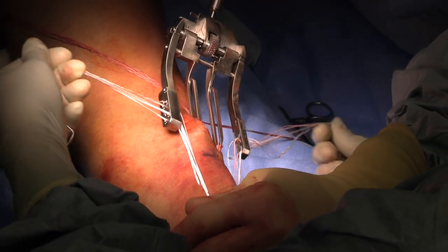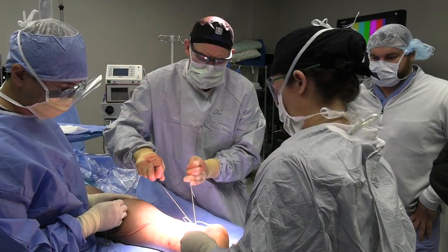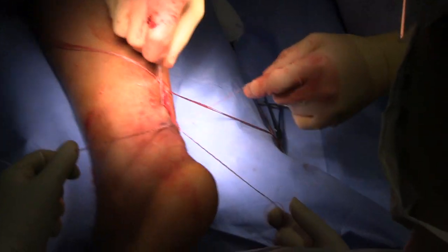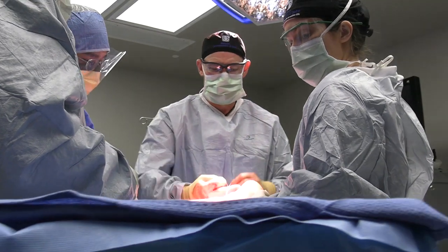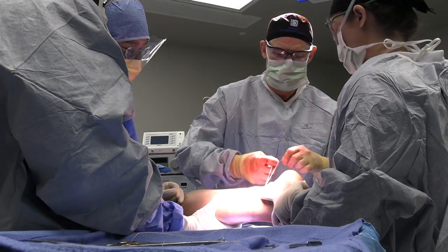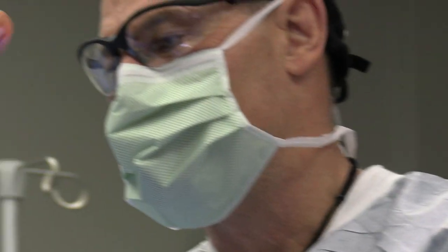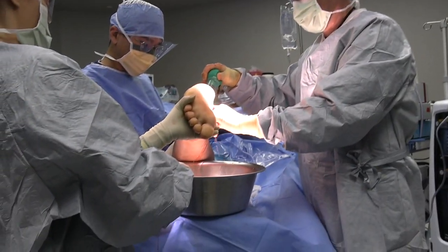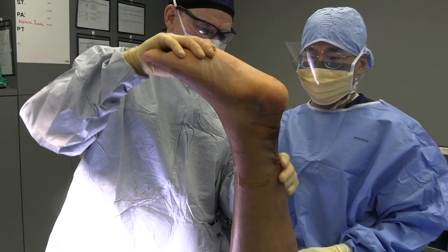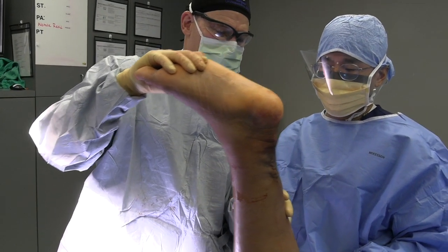This is pulling this on the inside. Most people have a white collagenous tendon and healthy muscle, which is why I normally make my incisions about half that big. Then we do the Thompson test — see how squeezing the calf causes the toes to point? That tells us how tension is set. You can see it's quite bent here; it doesn't reduce yet, and you can't get a plantar-grade foot.